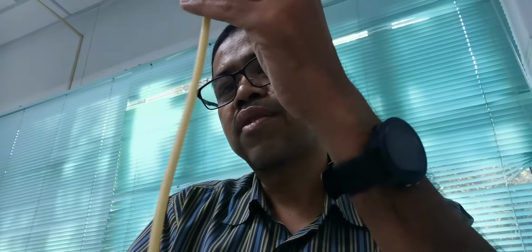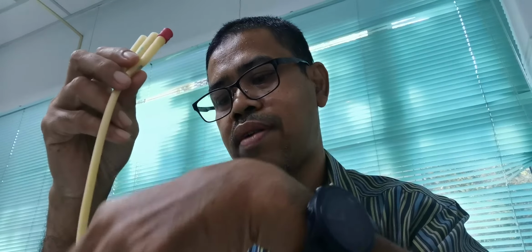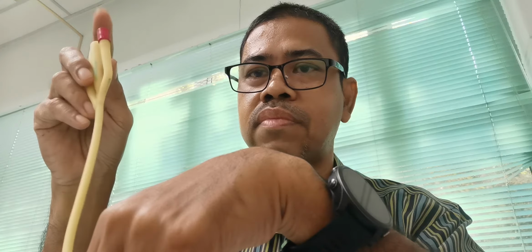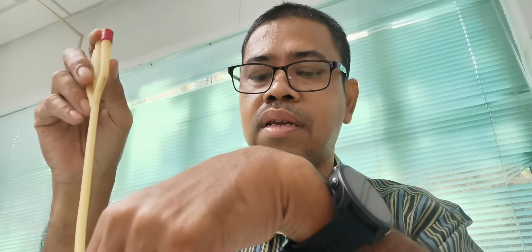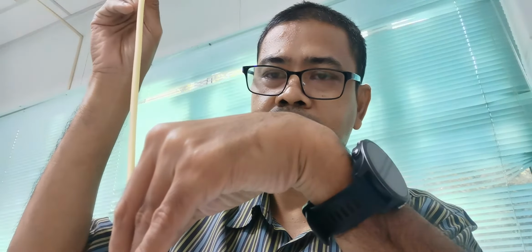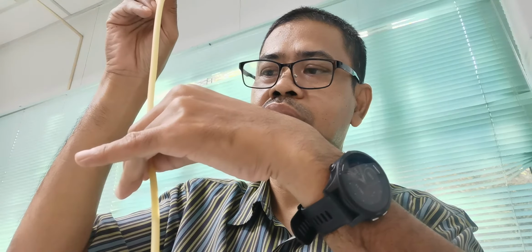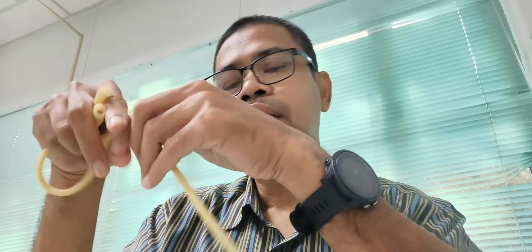Okay, how far do you insert the catheter? You insert the catheter and inflate the balloon. Once you inflate with the amount given, pull the catheter out until you feel the resistance. Then close the skin and anchor it at the skin. This is the one widely used in the urology department or general surgery ward.